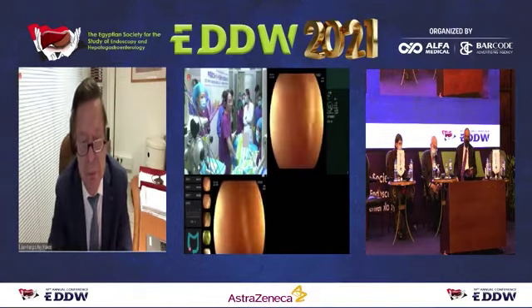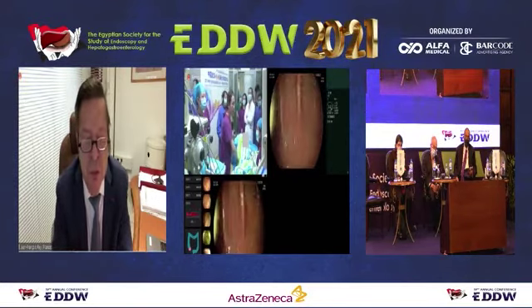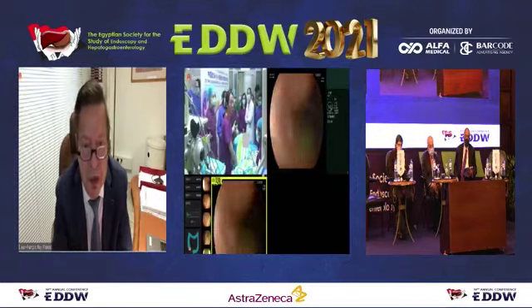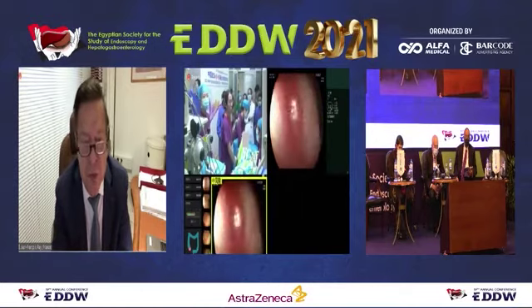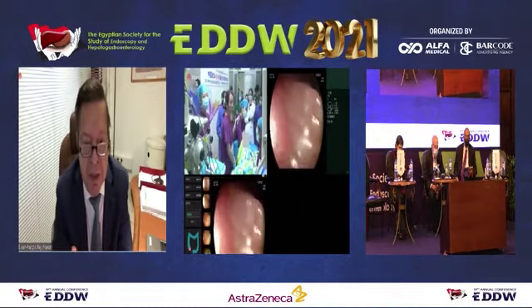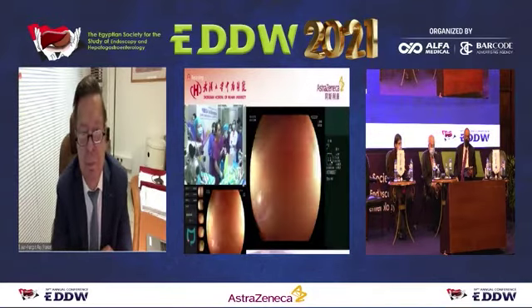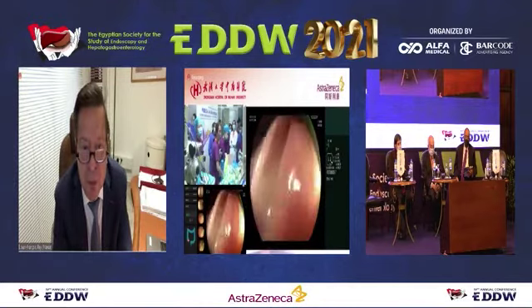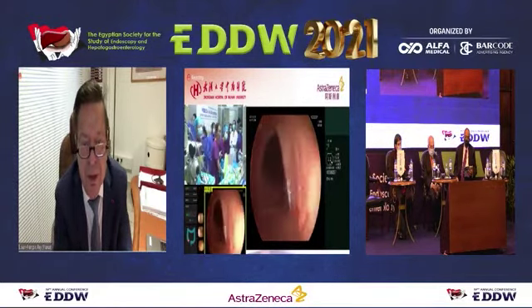Yeah, correct. If you want to use the special light, I suggest using the LCI. That's better. What is important is that for detection, you use the artificial intelligence with white light or LCI. And when you detect a lesion, then you switch to BLI. BLI allows you to characterize the lesion. I agree.